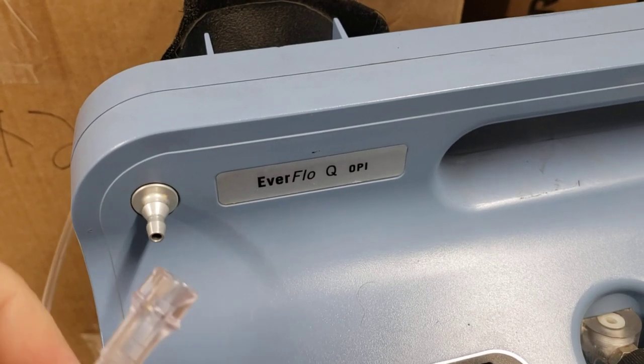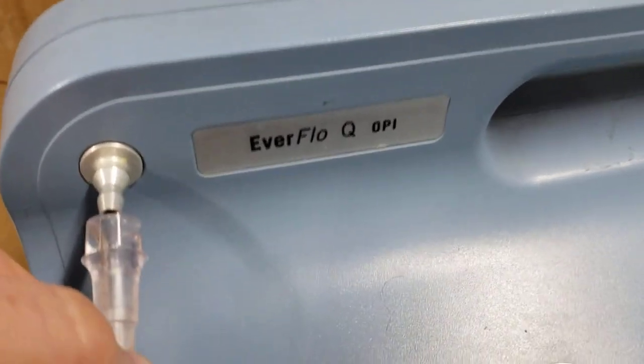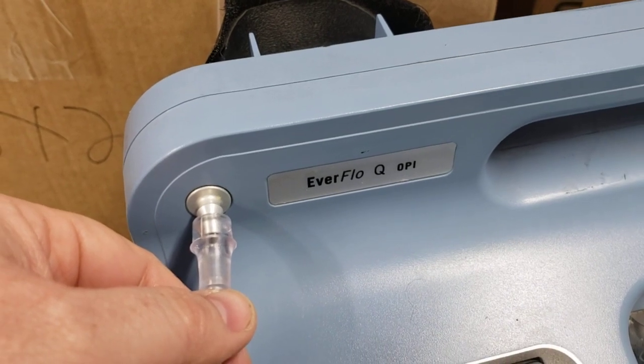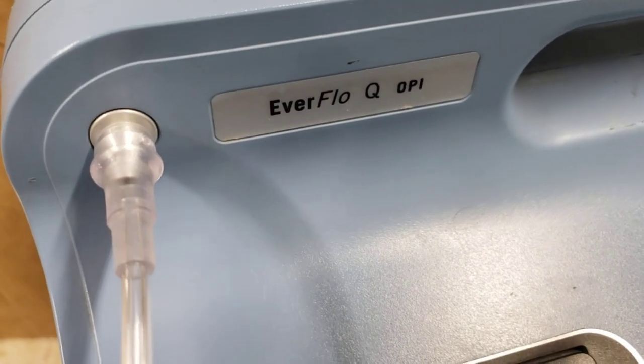I have an Everflow Q model here. The other end of that oxygen tubing is going to pressure fit right onto the output, which you'll find right there on the Everflow concentrator. Go ahead and push that in snugly. Once you've got that pushed in snug, it should look like that.